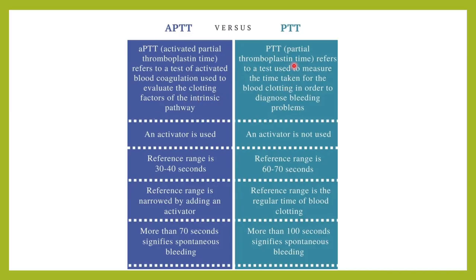Now PTT, that is partial thromboplastin time, refers to a test which is used to measure the time taken for the blood clotting in order to diagnose your bleeding problems. But in PTT, we are not using any activator. Okay, whereas in activated partial thromboplastin time, we are activating the process. So here we use an activator. That is the only difference.